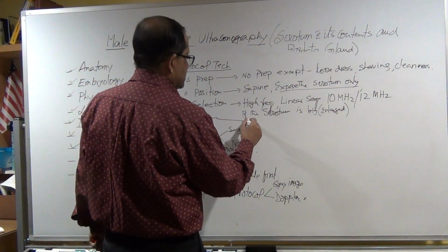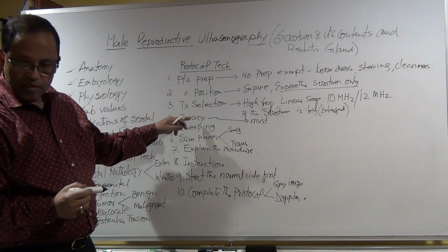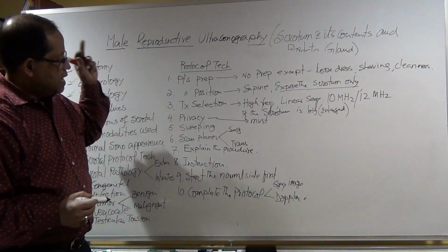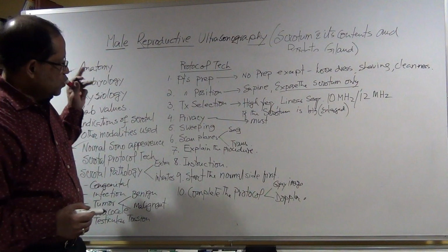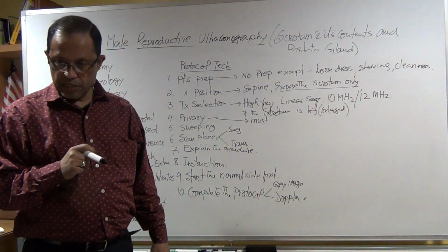Privacy is a must, because it's a sex organ, okay? It's a sensitive organ, so that nobody can complain. So what is the procedure? Do not make frequent eye contact.